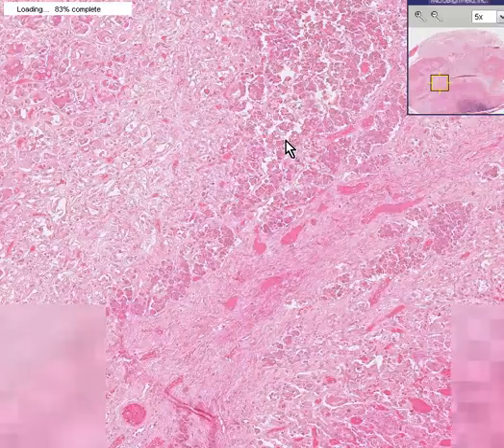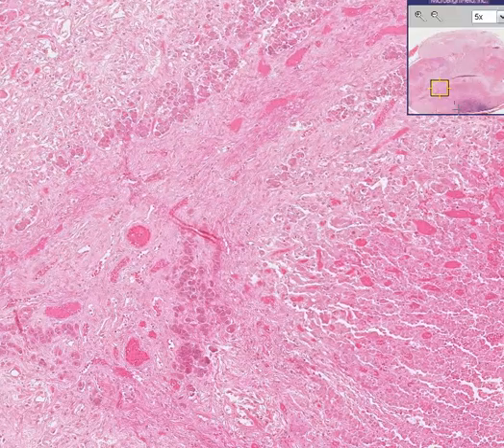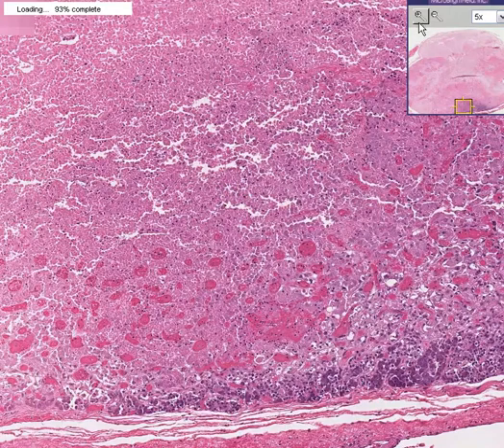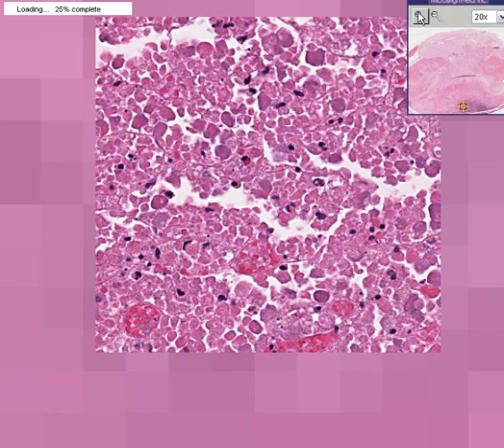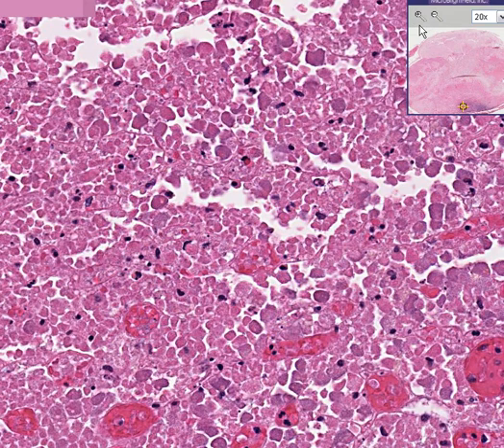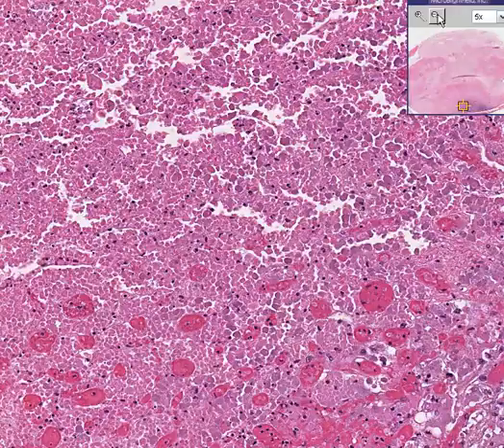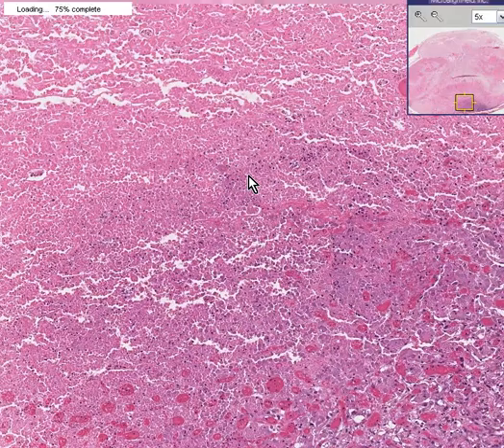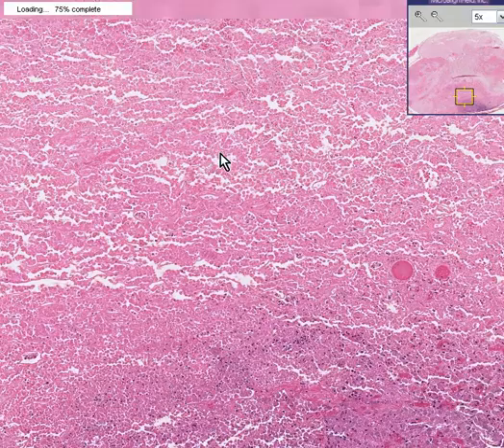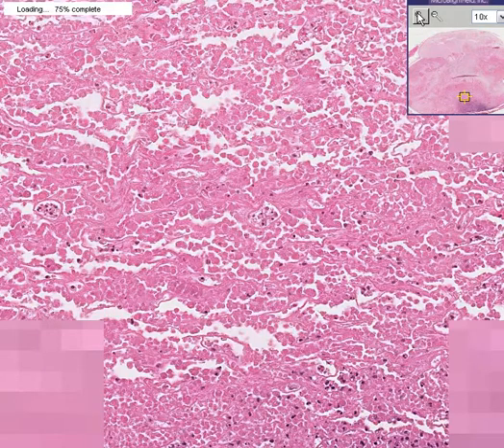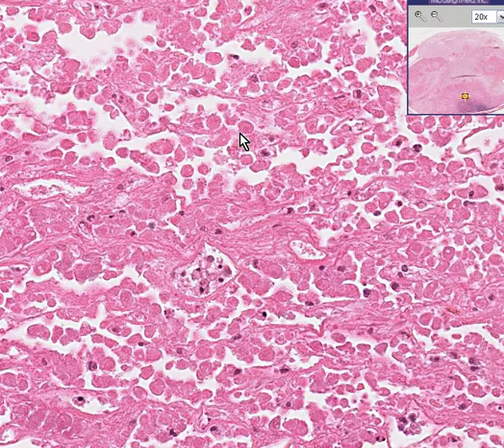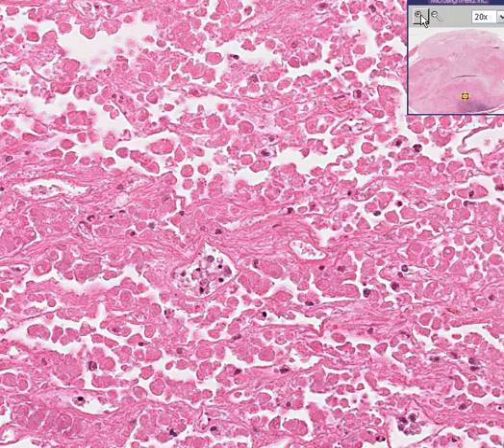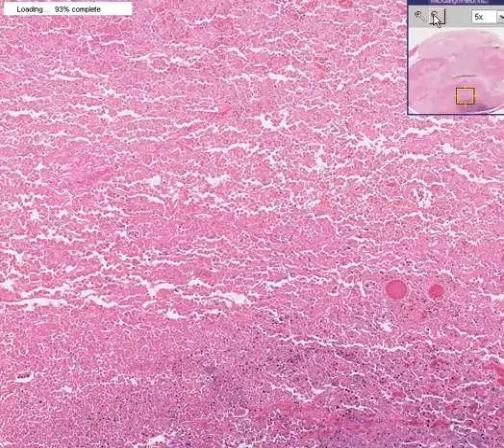In the anterior pituitary — the adenohypophysis — there are areas that look like they are necrotic, in which you don't see much cellular detail at all. There's perhaps some ingress of neutrophils as well. In addition, there are other fairly poorly defined zones in which you have just a total outline of cells with not much nuclear detail, like coagulation necrosis. This is an infarct of the pituitary.